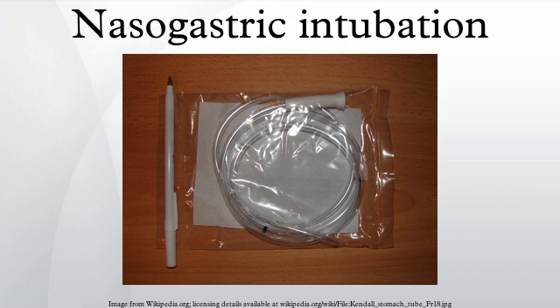Nasogastric aspiration is the process of draining the stomach's contents via the tube. Nasogastric aspiration is mainly used to remove gastric secretions and swallowed air in patients with gastrointestinal obstructions. It can also be used in poisoning situations when a potentially toxic liquid has been ingested, for preparation before surgery under anesthesia, and to extract samples of gastric liquid for analysis.